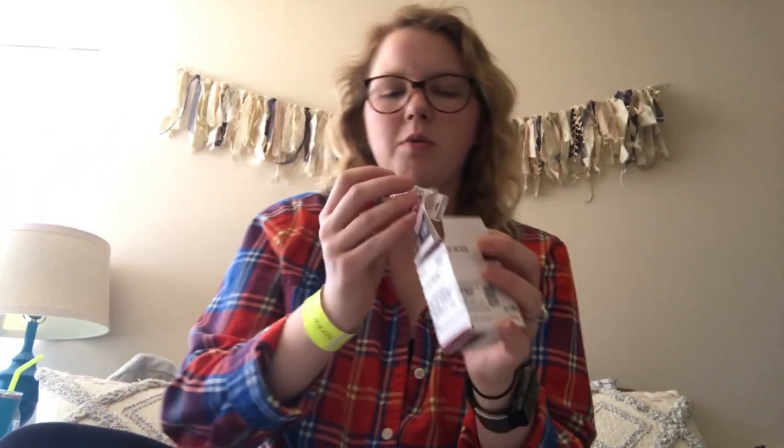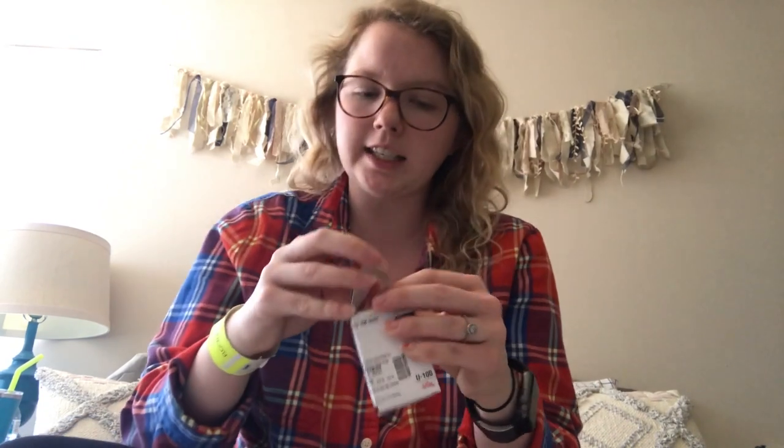I'm going to slide this new one in right here and say 'okay, detect the cartridge.' Then I'm going to put my insulin back in its box — it has to stay in the refrigerator. This one does not have to stay in the refrigerator because it's on my body; it's good for about five days out.